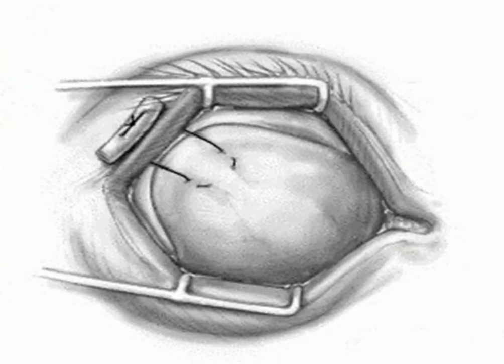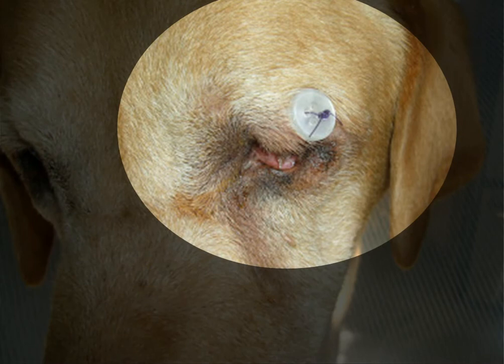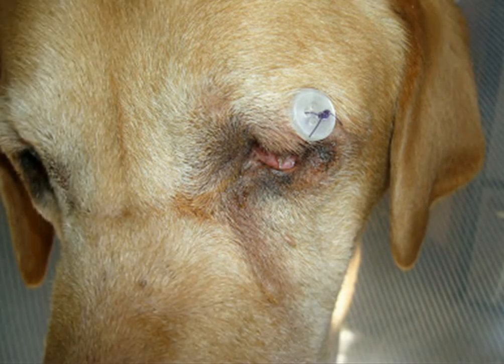Then the two ends of the silk thread pass from the inner aspect of the upper eyelid, at the dorsal lateral corner — the temporal region of the eyelid — to end at the outer surface. They are then threaded through a button to avoid lacerations and to permit easier untying.